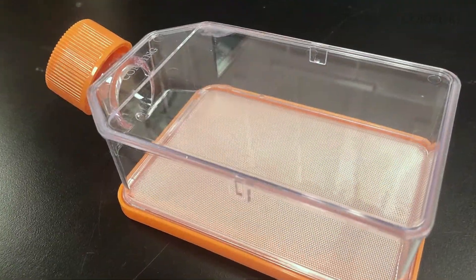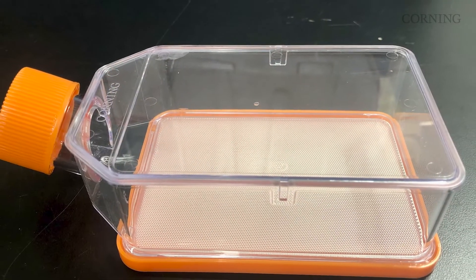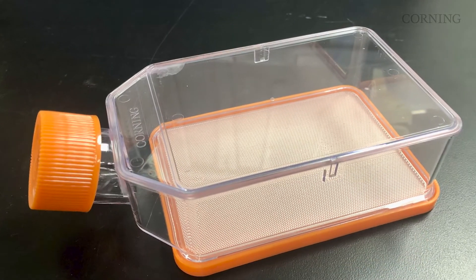Exciting features of this flask include the ultra-low attachment surface which prevents the attachment of cells, the unique micro cavity substrate which allows for the ease of formation of spheroids, ease of media exchanges and handling during culture, and also allows for the collection or harvest of spheroids when desired, and the optically clear polystyrene film which enables you to visualize your spheroids throughout culture.